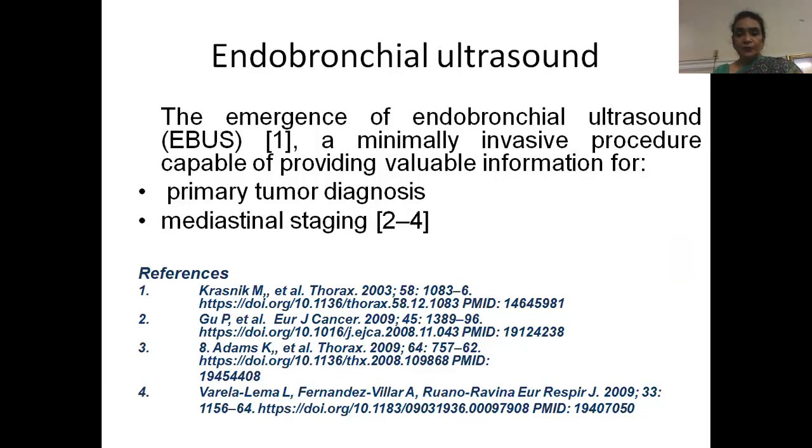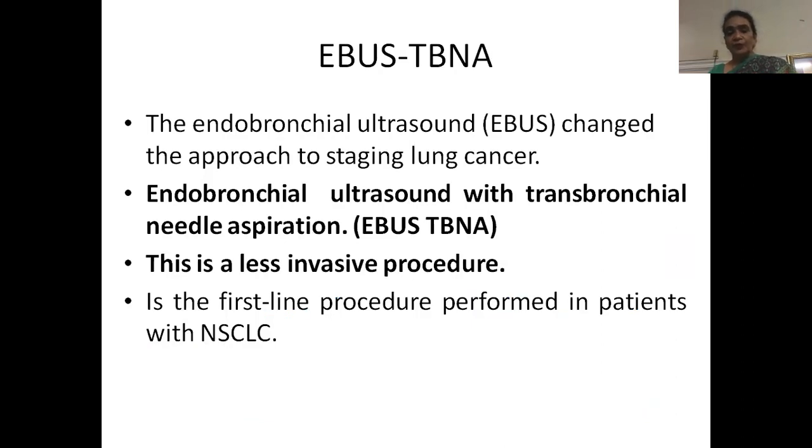With the emergence of endobronchial ultrasound, a minimally invasive procedure, we can probably obtain valuable information for primary tumor diagnosis and mediastinal staging. Endobronchial ultrasound, when combined with transbronchial needle aspiration, is the less invasive procedure and is the first line of choice for patients with non-small cell lung cancer.